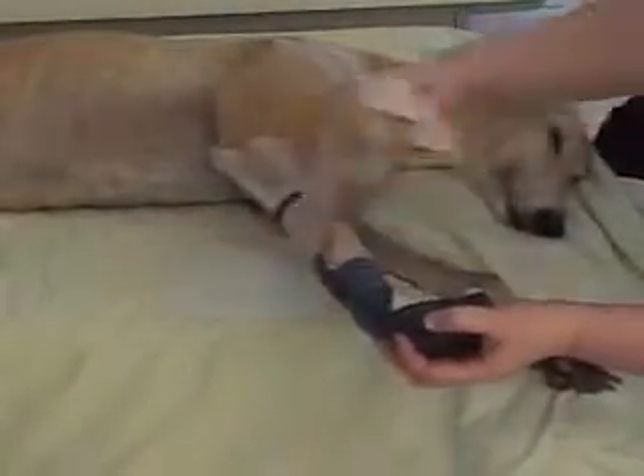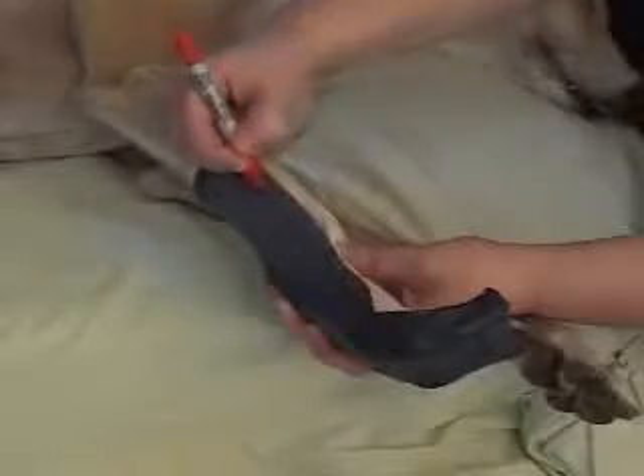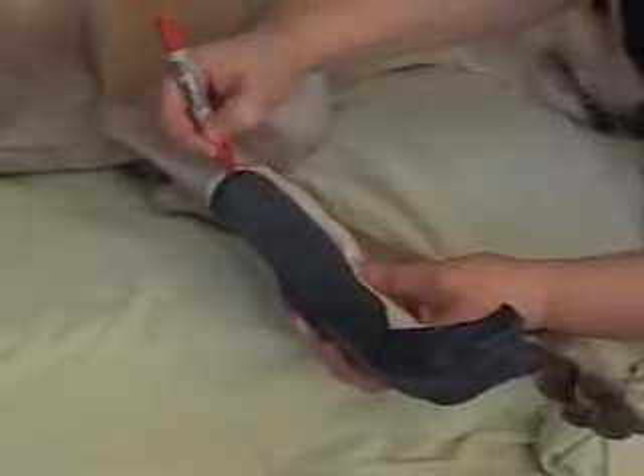At this point, the ACE bandage can be removed. While the splint is on the animal, mark any areas of excess material that will need to be trimmed.